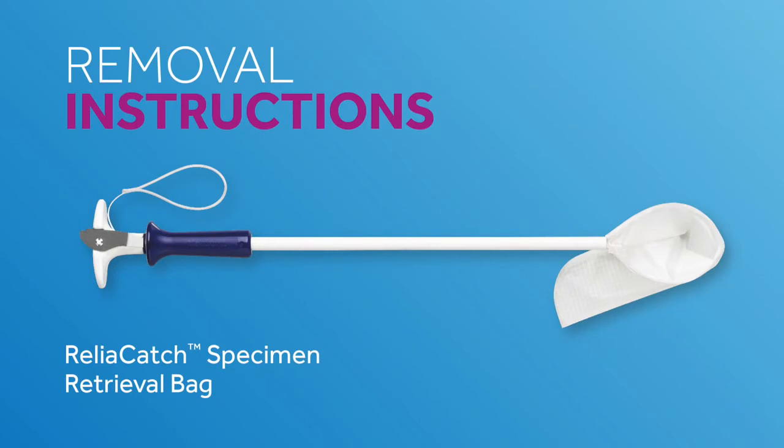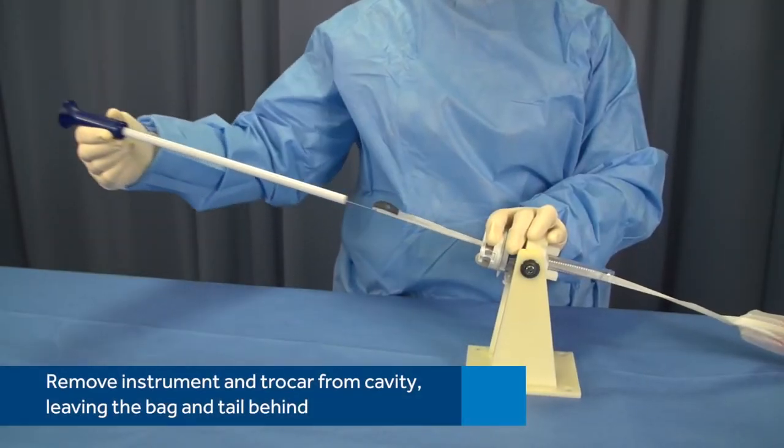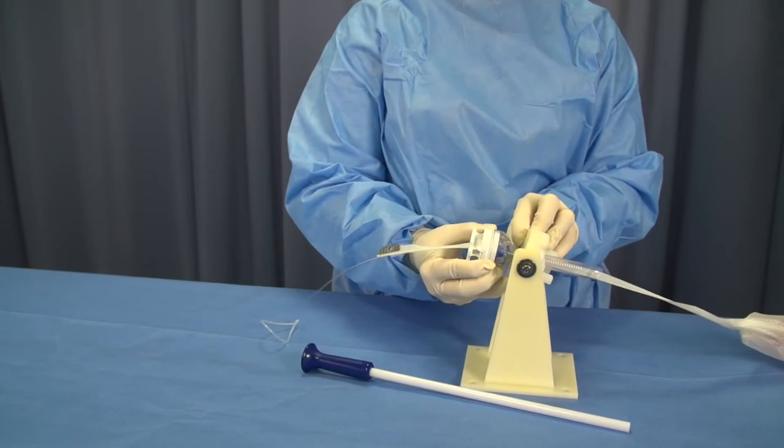Finally, let's take a look at how to remove the instrument, specimen bag, and Trokar. Remove the instrument and Trokar from the body cavity, leaving the bag and tail behind. Do not attempt to pull the bag through the Trokar or outer tube of the instrument.